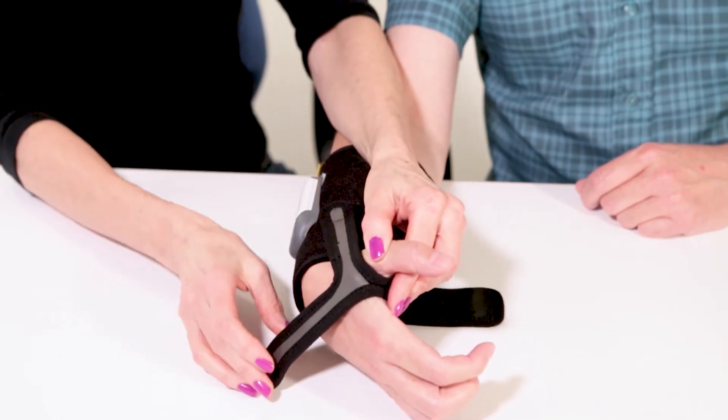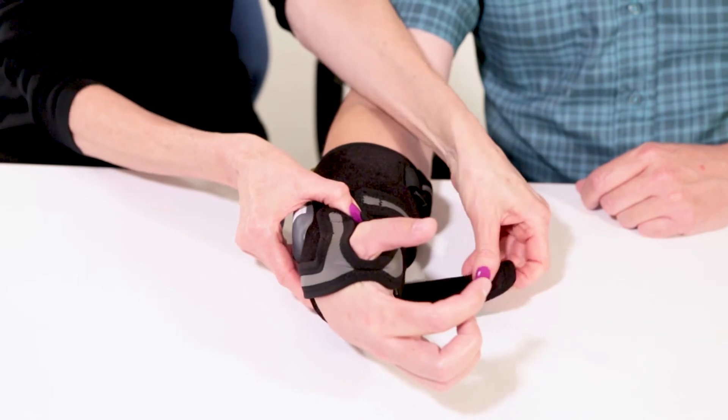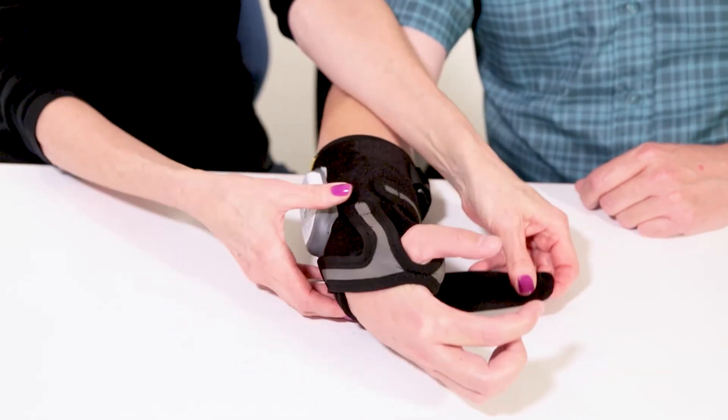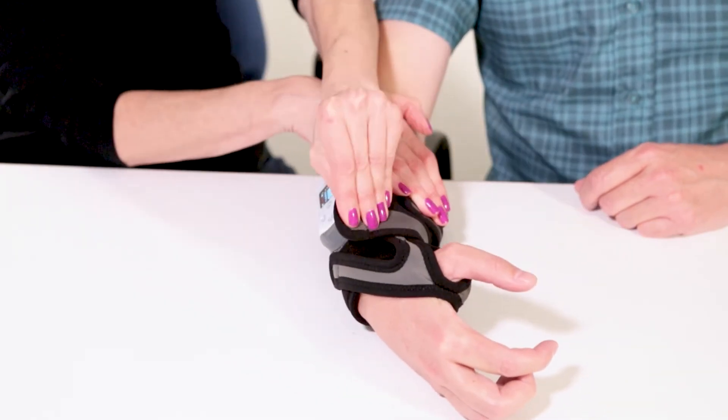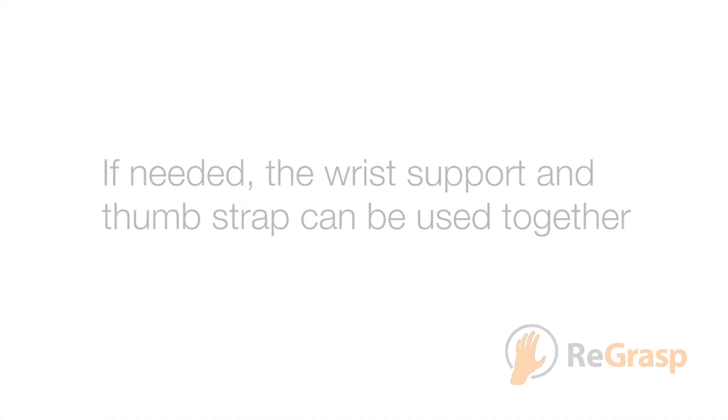Attach the thumb strap to the garment. The thumb strap should attach to the garment under the garment's wrist strap. It needs to be snug to ensure good contact between the electrode and the skin. If needed, the wrist support and thumb strap can be used together.